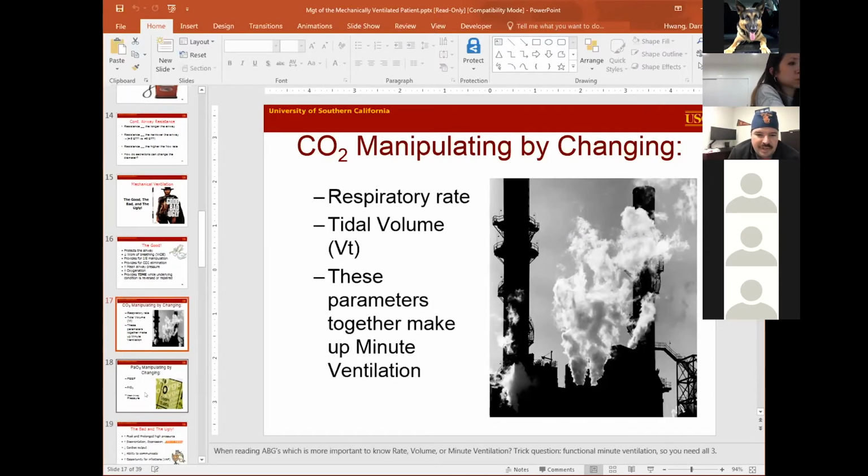The main focus for the ventilatory side is keeping a balance of the patient's pH. Usually this is compensating for the amount of CO2 in the body, which we try to keep around 40 for most people. This is done by moving the right amount of air in and out of the lung while we have them sedated and not spontaneously breathing. Let's continue.